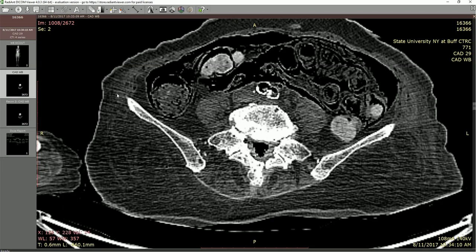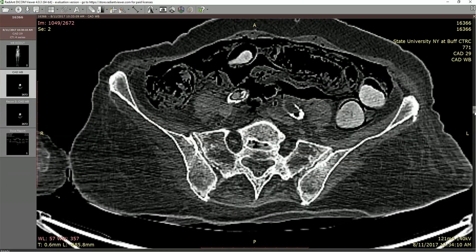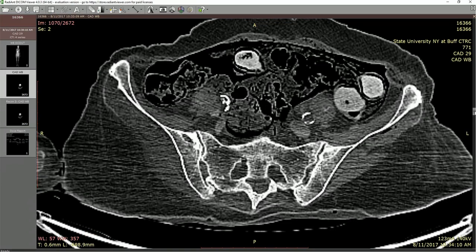There we go — we're going to make out the aspect of the sacrum. We have the sacroiliac joints visible, and you can see the roughened appearance because they are not smooth articulations, which prevents excessive unwanted movement. At this level you've got iliacus on one side, psoas major over here, and then the start of the gluteus maximus on either side. The soft tissue is showing up quite nicely.